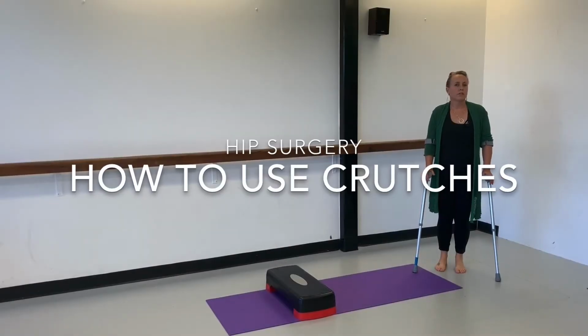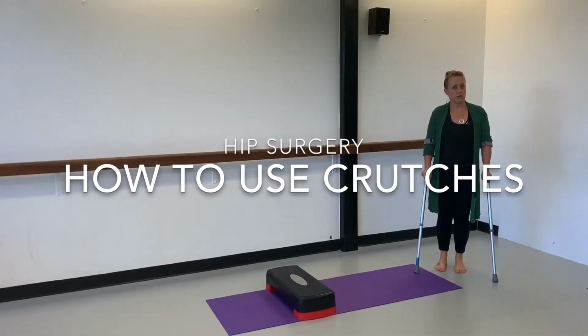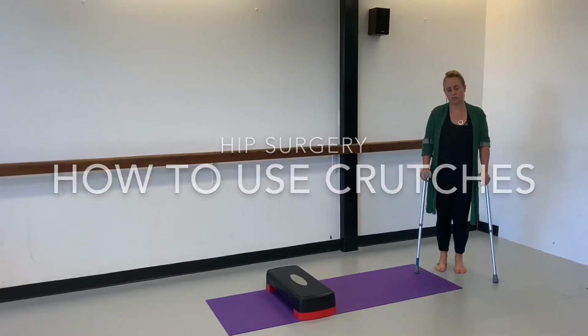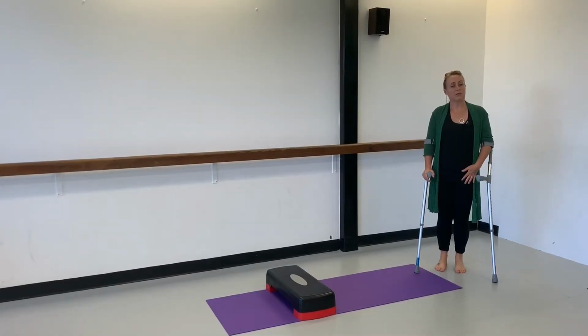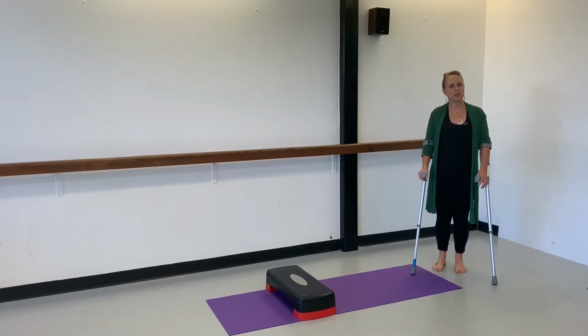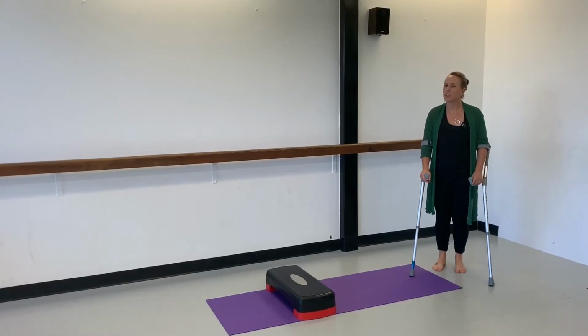It's important after your surgery to know how to use your crutches correctly to make sure your walking is as symmetrical as possible. So remember that your hip replacement can take your weight, there's no problems with that, but often after surgery you're limping because you've got some pain post-operatively, and also you might have been limping prior to your surgery. So your crutches are there to help make you feel more balanced, but they're also there to give you a more even and symmetrical walking pattern.